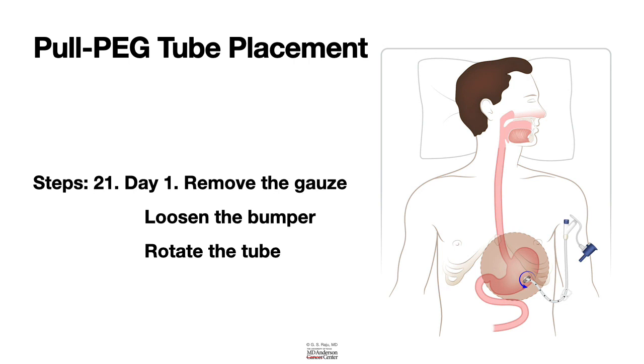So we have learned about how to place a pull PEG tube. There are multiple steps, and it's important to learn how a PEG tube is placed. This is one of the commonly used procedures in hospitals and ambulatory surgical centers.